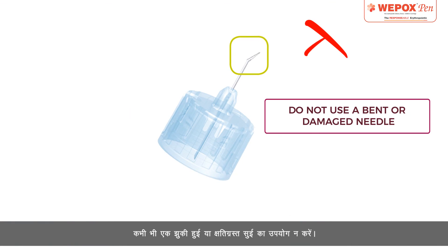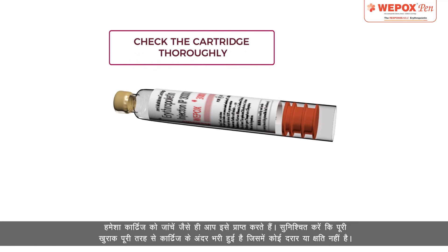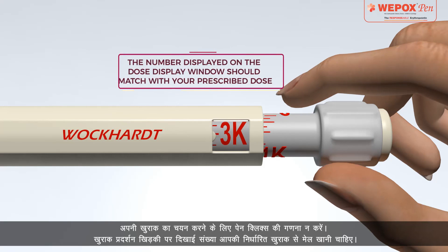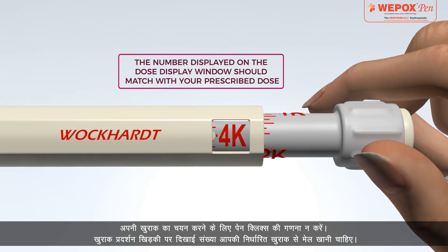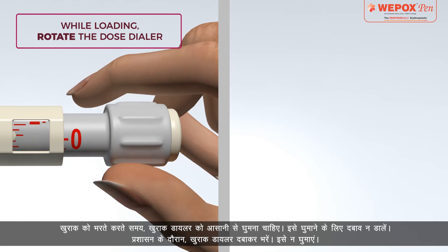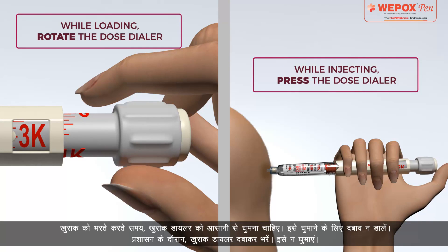Never use a bent or damaged needle. Always check the cartridge as soon as you receive it — make sure it is fully filled with no cracks or damages. Do not count the pen clicks to select your dose; the number on the dose display window should match your prescribed dose. While loading the dose, the dose dialer should turn easily — do not force it. During administration, inject by pressing the dose dialer; do not rotate it.